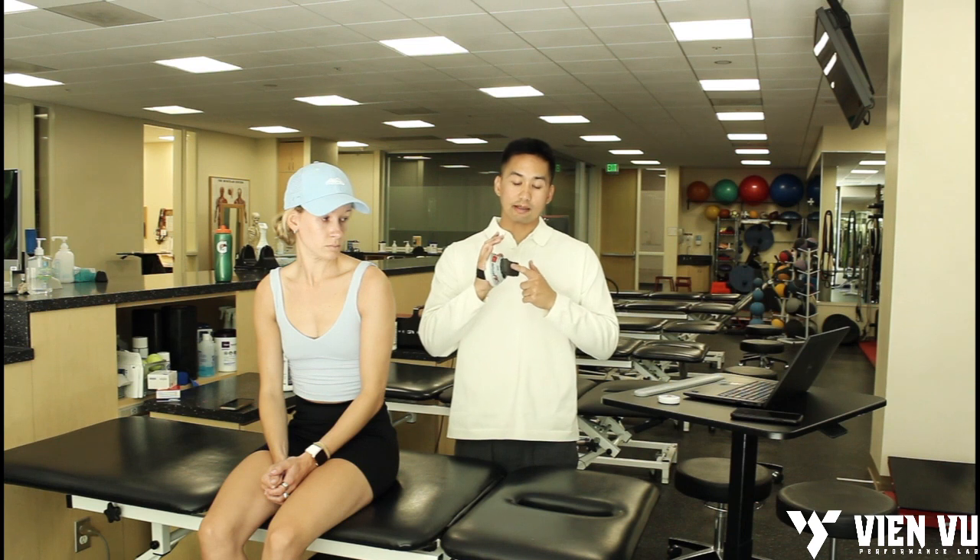This is specifically for a hip test. A lot of therapists and athletic trainers have access to micro-FET, so hopefully this will decrease the barrier into hip testing. The main difference between testing with the micro-FET versus an app-based dynamometer — there are other videos posted for that as well.